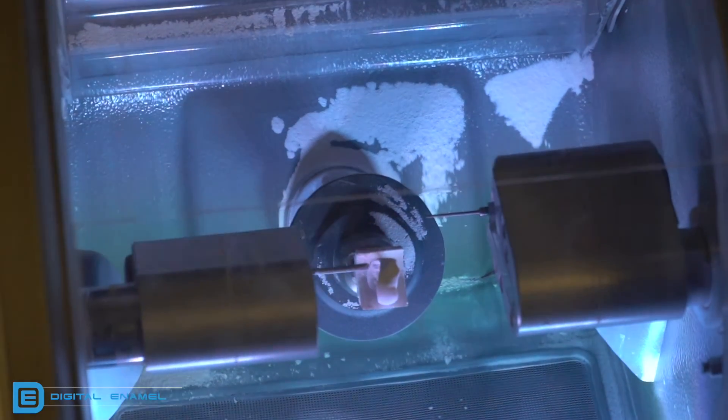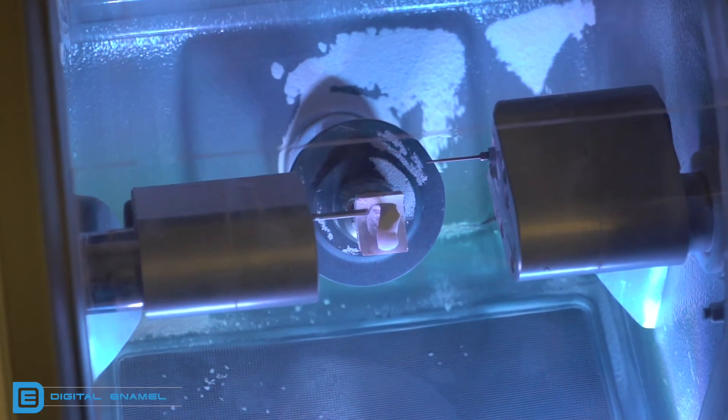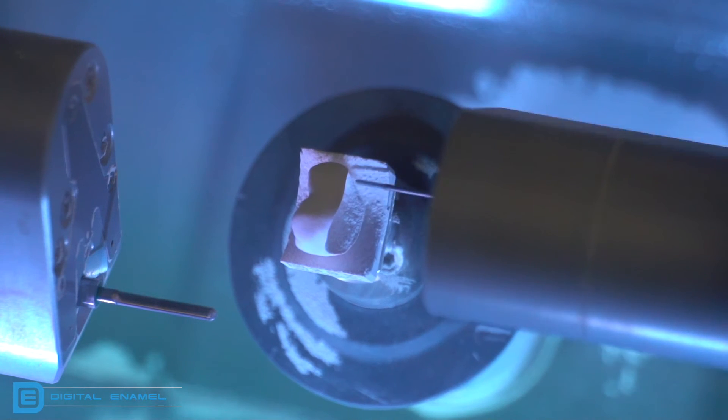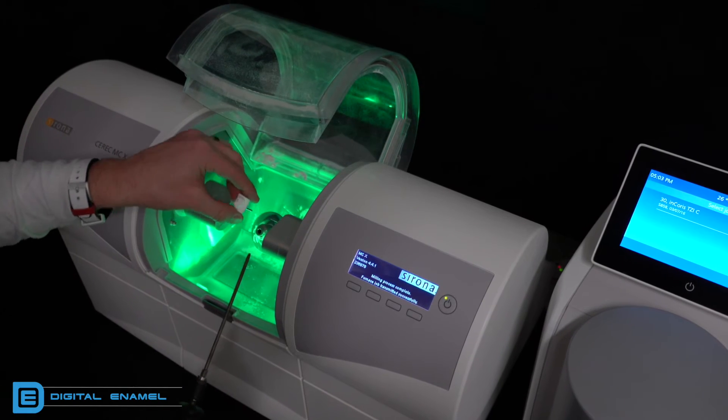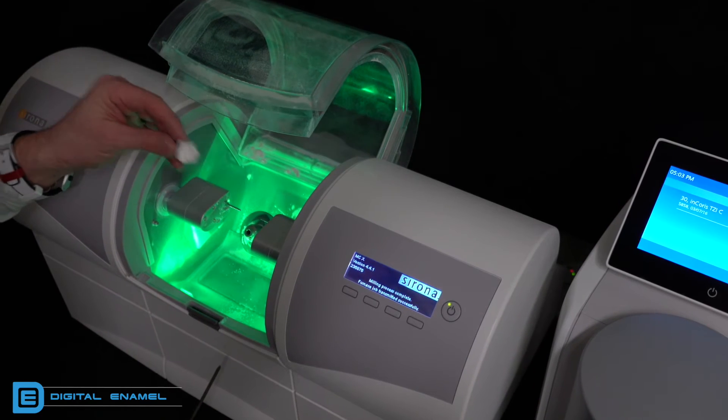Put the block in the milling chamber and the dry milling process begins. For an average size molar crown, it takes about 12 to 15 minutes to mill. When you take the block out of the milling chamber, be very careful not to crack it off the sprue. This zirconia is like very hard compressed chalk and you don't want to damage it. Some people show others cracking it off — I highly suggest not doing that because it will crack into the wall of the restoration and then you have to mill it all over again.